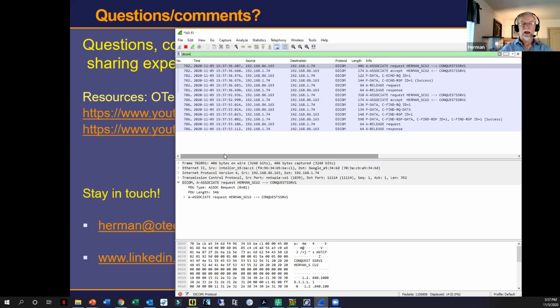And as a matter of fact, I think eventually, if you have an EMR, Cerner for example, or Epic, you can schedule it there. Then you have a single modality worklist provider anyway. You don't even have HL7 messages going back and forth. It's a single interface modality worklist provider, depending on your departments, but it could actually be ophthalmology. You could schedule endoscopy, whatever it is.